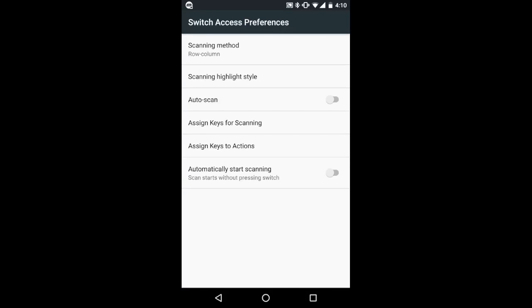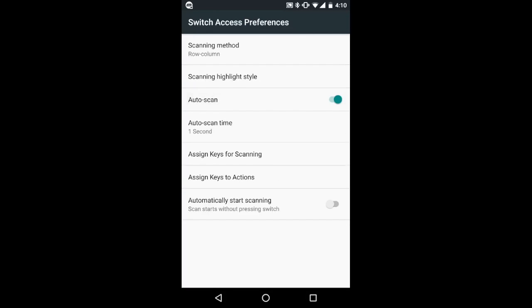If you are using single switch access, select enable auto scan. A time delay option will now be available to set the scanning rate. The default is set to one second.